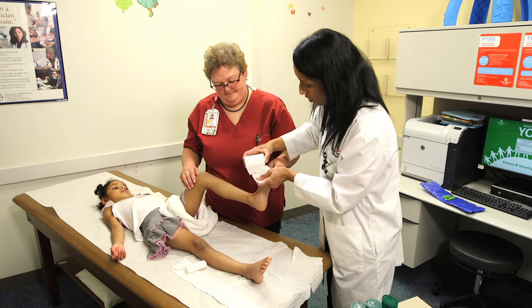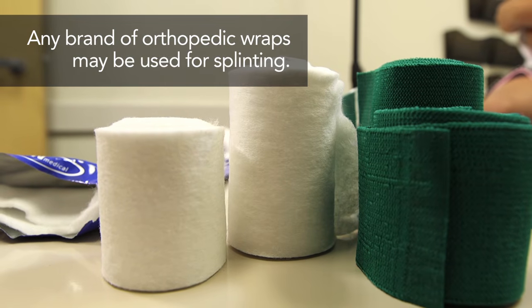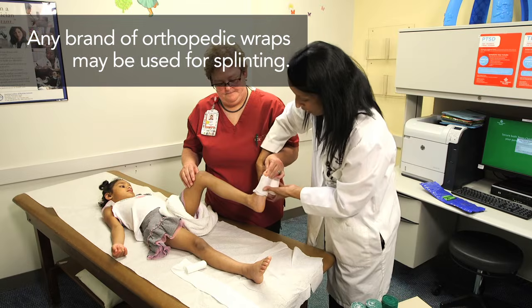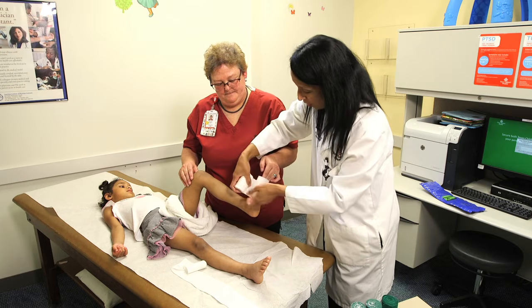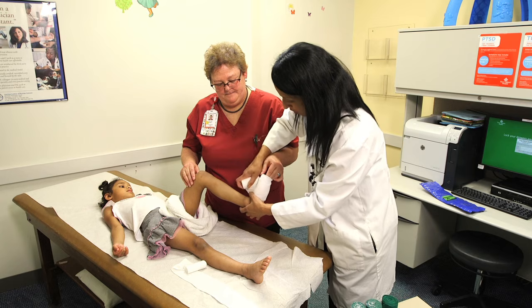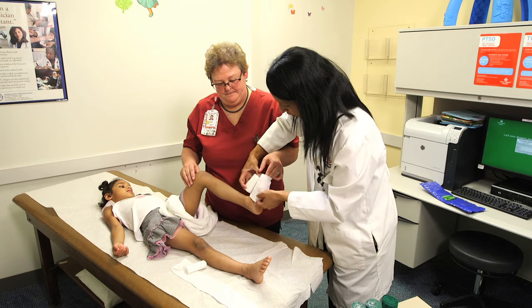We're going to wrap them with this web roll, which is a soft lining. This is to further prevent any sores from developing, and it provides a layer of cushion between the injured extremity and the hard splinting material.